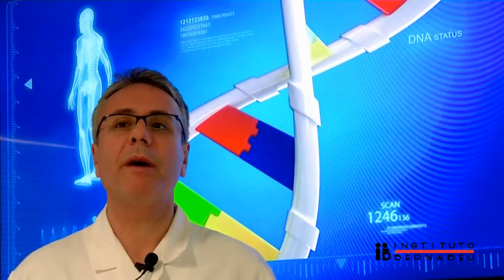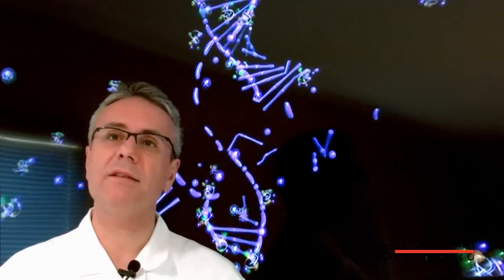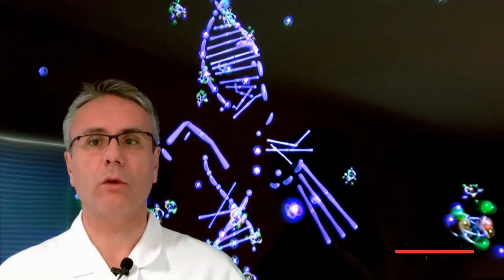New technologies are making remarkable progress in the diagnosis of fertility. The latest development that has been incorporated into the range of diagnostic techniques is called Array-CGH. This new genetic test allows us to analyze our cells' DNA to limits that years ago we would have considered pure science fiction. The human genome is made up of 46 chromosomes, 23 from the father and 23 from the mother. All of our organism's genetic information is stored in these chromosomes.